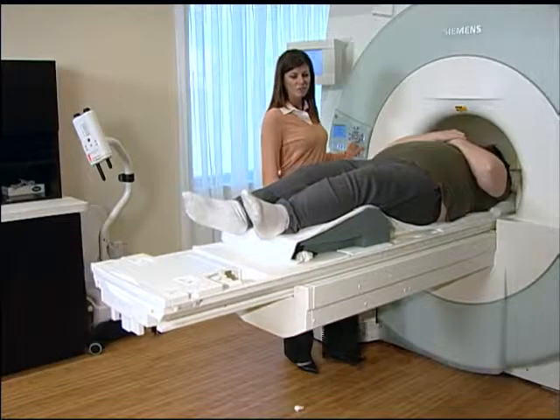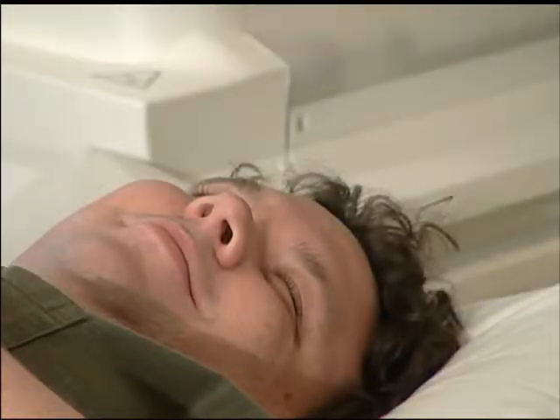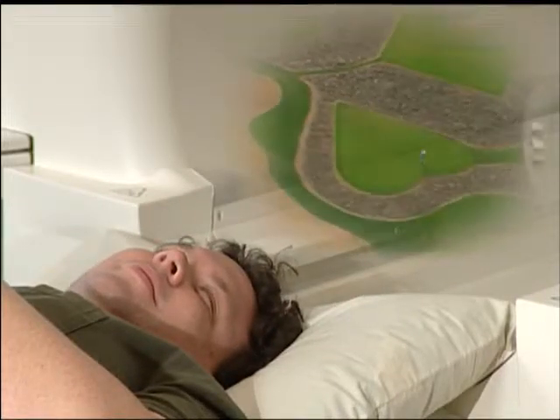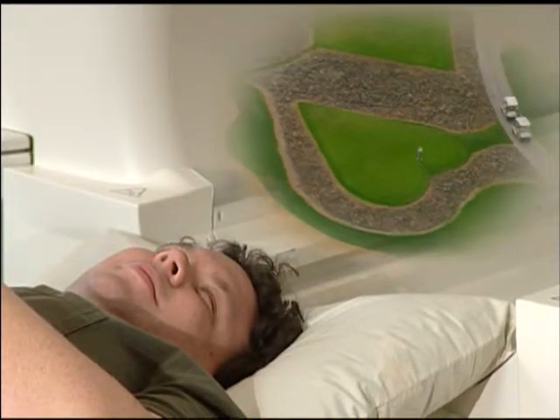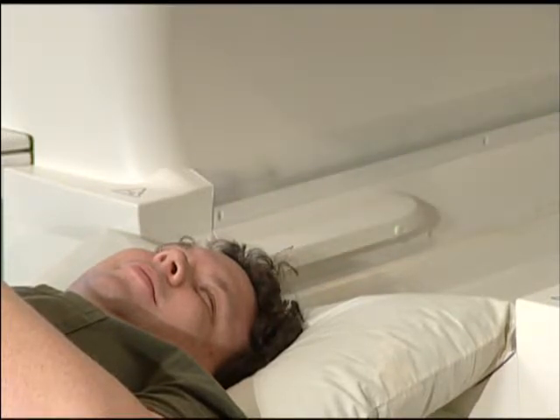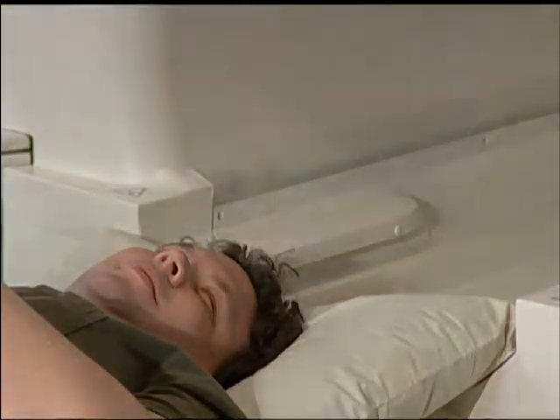Although the MRI exam is painless, it does require you to remain still until the exam is complete. Patients often try to nap. Mr. Smith enjoys golfing a lot. Perhaps he's thinking about his favorite course, concentrating on how relaxed he feels when he's playing. Think about something you enjoy doing. It really helps.